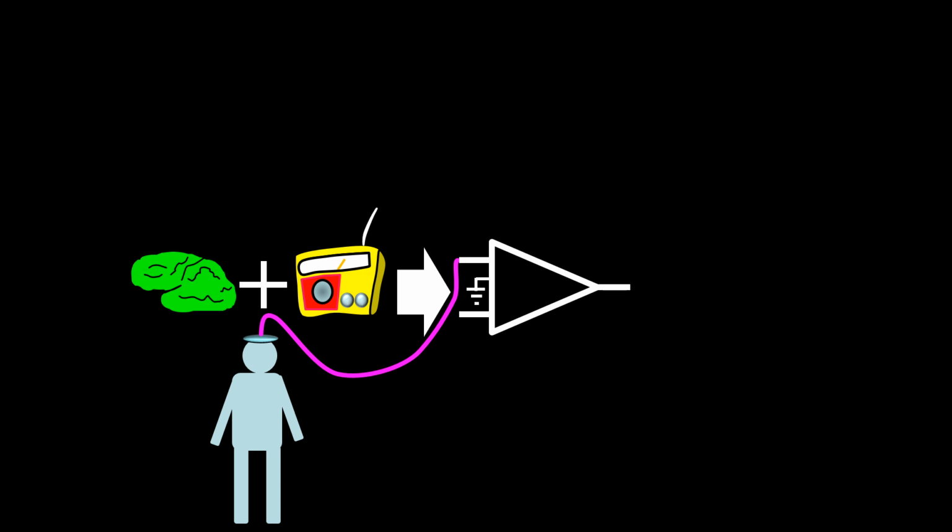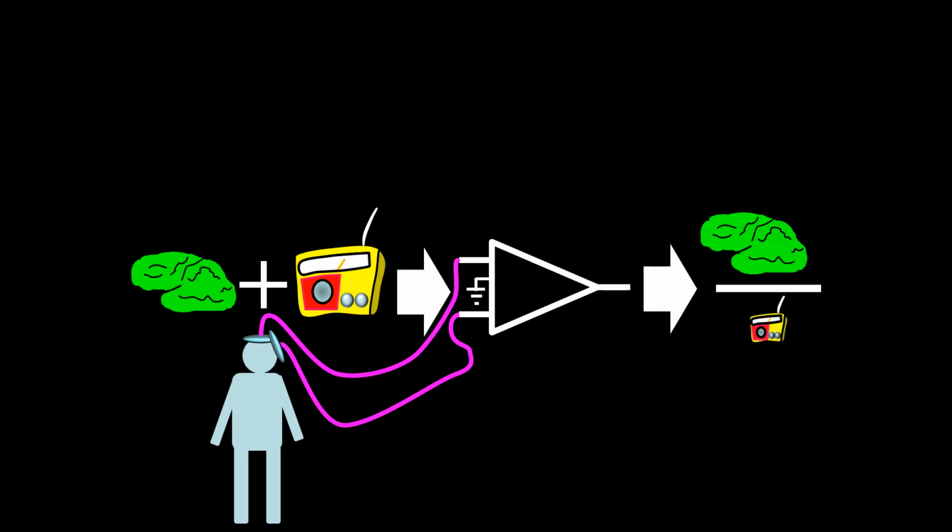And finally, the obvious was done, that was to place the reference electrode, that is the electrode connected to the input 2 of the differential amplifier, on the scalp. This placement provided the best results most of the time, yielding a relatively noise-free reference, or at least almost noise-free reference. And it is in this fashion that all electrical data is transmitted from the brain to the digital EEG at this time.